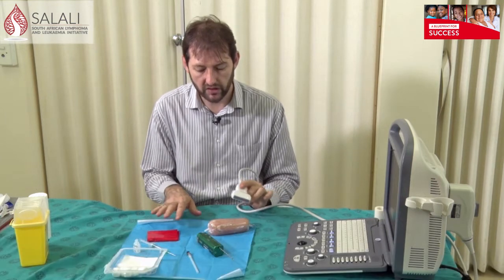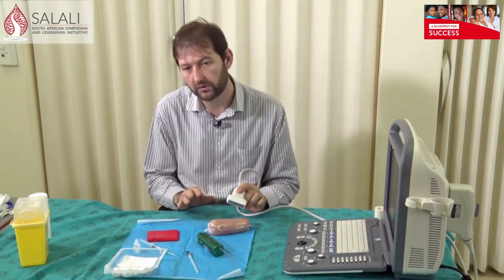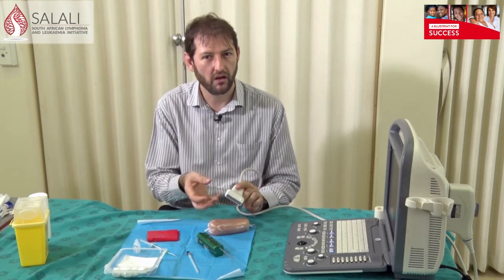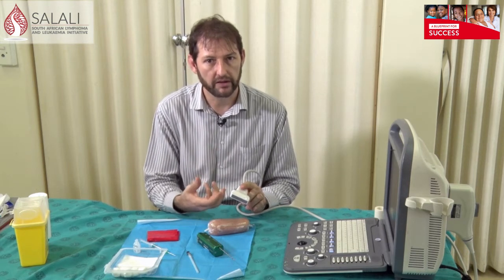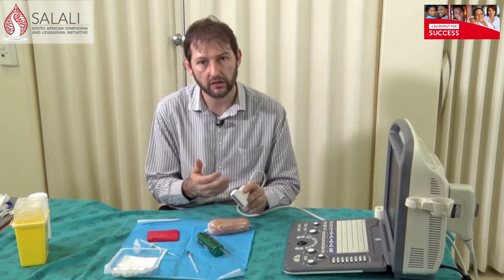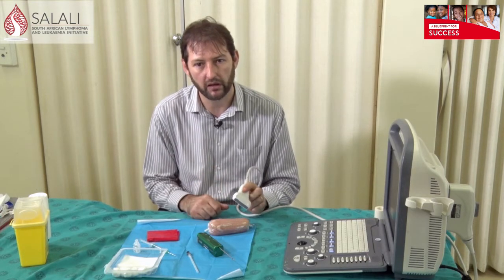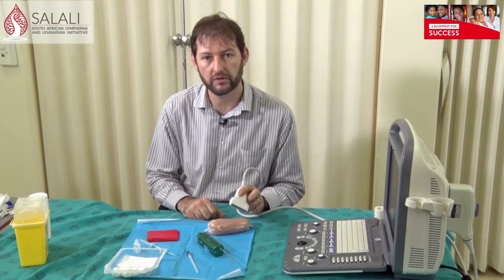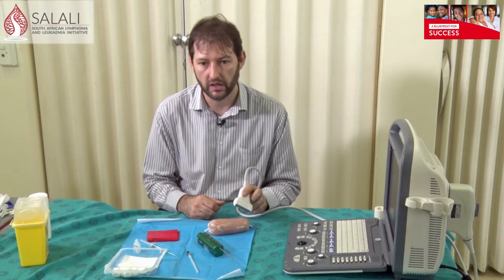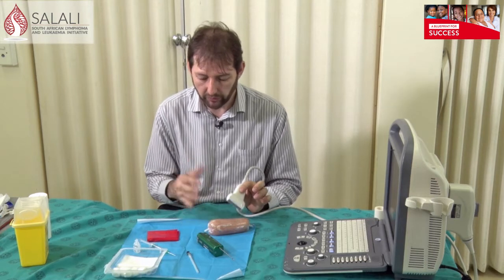I'm going to show you the setup for doing an ultrasound guided biopsy. Tell your patient what you're going to do and get informed consent beforehand. I start by laying out the tray — I use the dressing tray, which is what's available. You can get ultrasound covers for your probe to keep it sterile and to keep blood out of the grooves, so I would recommend using some kind of cover for your ultrasound machine to make it safer for your patients.